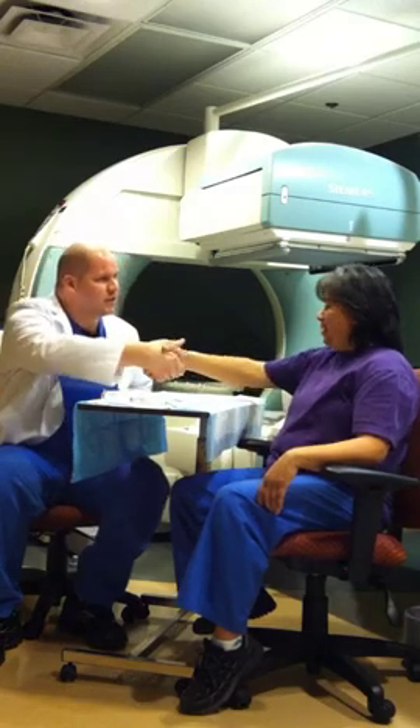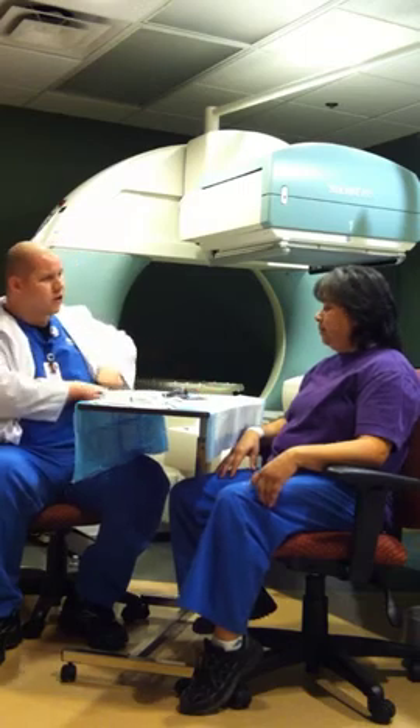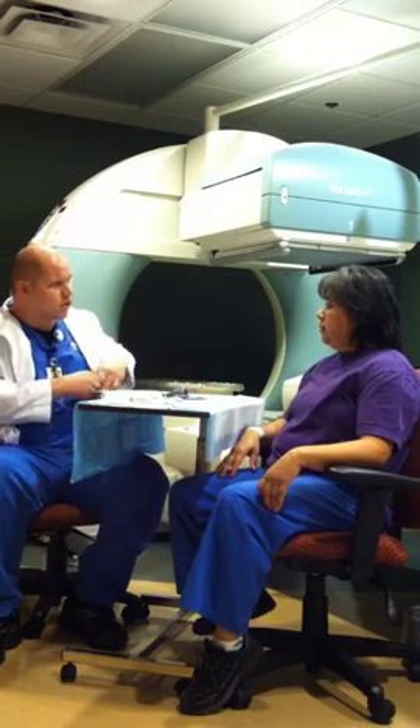Hi, my name is Todd. Hi. How do you do? So, Maria, looks like the doctor's ordered a MUGA scan for you. Have you ever had a MUGA scan before? No. Okay, so what's going on that the doctor would order this?